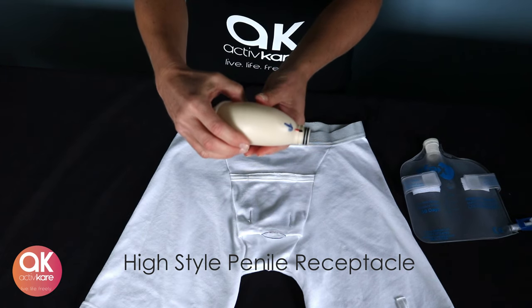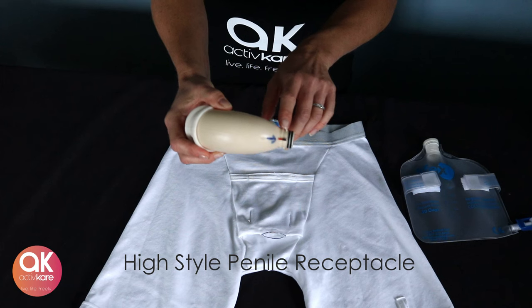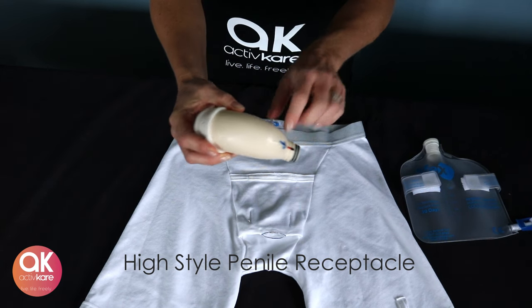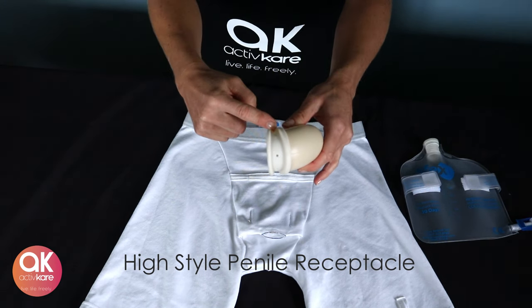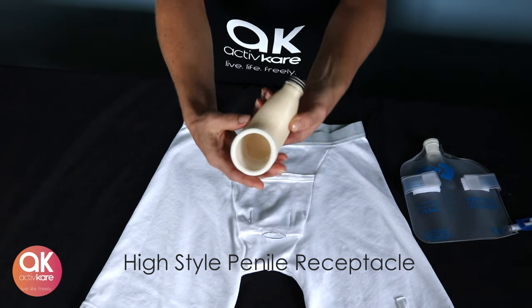The High Style Apex is an adhesive-free penile receptacle. The receptacle nozzle is where it attaches to the collection bag with a simple turn and click. The high receptacle features ventilation to prevent pressurized air from entering the collection bag during activity.